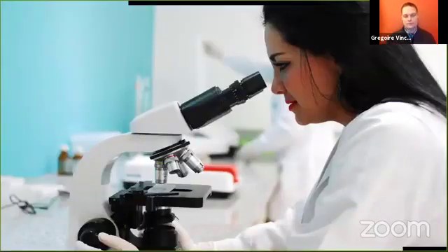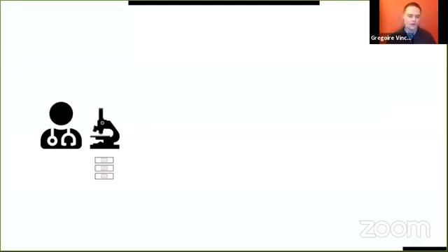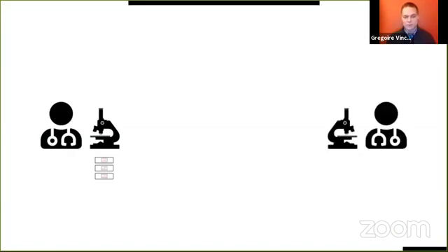The big difference with radiology is also that pathology is very lonely work. Why? Because when you observe a sample under a microscope, the slide is very thin and fragile, and it has been very difficult to obtain the sample, so you don't want your slide to get broken. So when you need a second opinion, for example, to confirm a diagnosis, but also in research, when you want to better understand what is occurring in this tissue, it's very difficult to share the information and the slides.